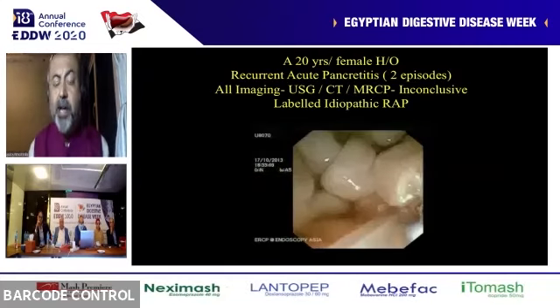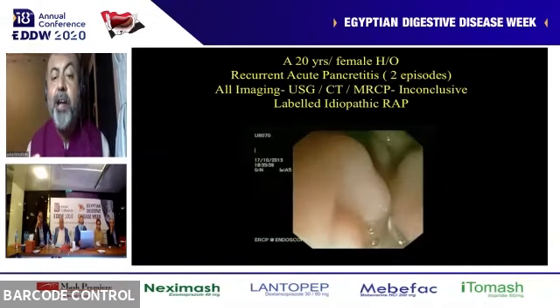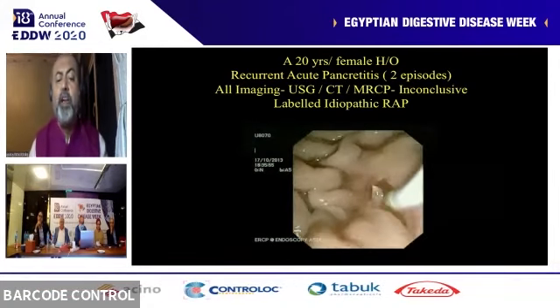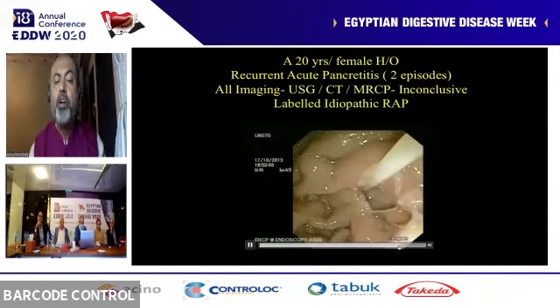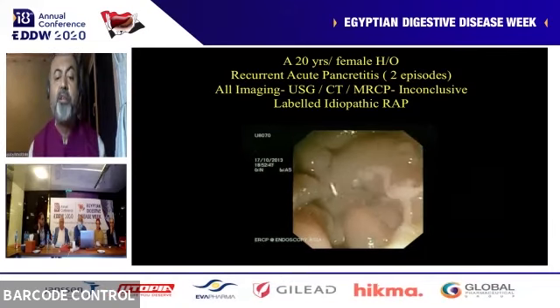Crazy, isn't it? So we always thought that pancreatic juice will kill ascaris. It does not happen that way. It does not get digested in the pancreas. So this is a myth which we have to overcome. And with a lot of tug of war, we finally managed to drag this thing out and then place a small stent, and this girl recovered beautifully thereafter.